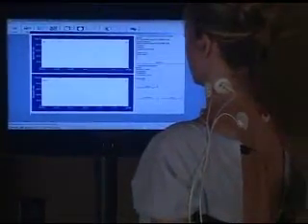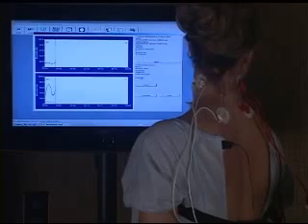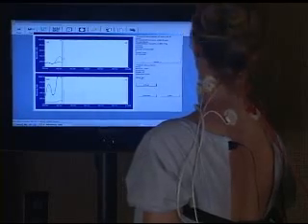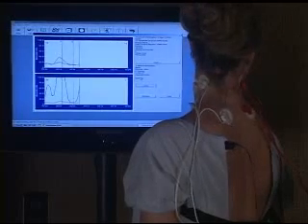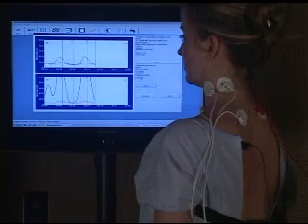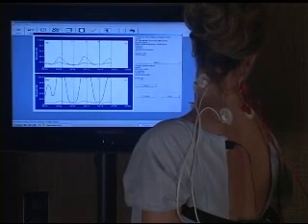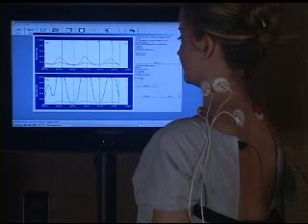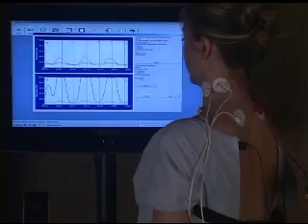And again, you're marking the peaks and valleys. So we begin our right rotation. Mark with the button to the right, peak, back to the center, valley. To the right, peak, back to the center, valley. Mark it, to the right, peak, press and release, back to the center, valley, press and release. Now if you have to redo, click the clear button on the screen.